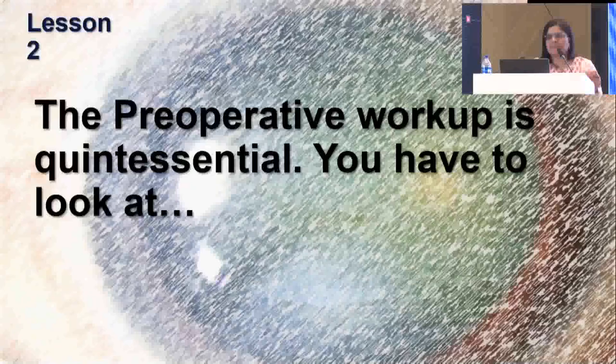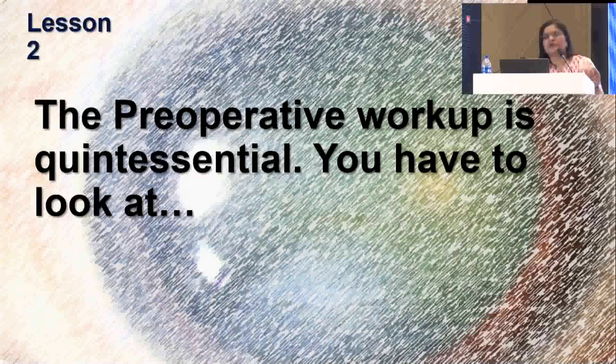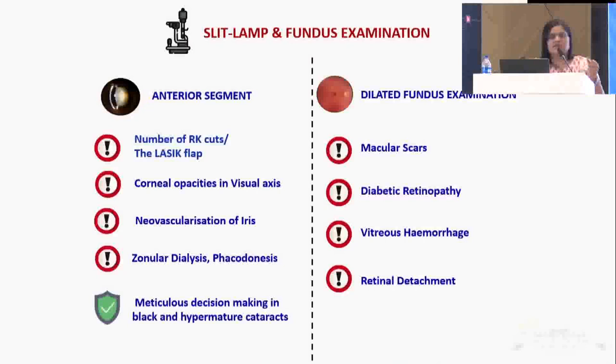With this, lesson number two: the preoperative workup is quintessential. You have to look at the slit lamp and fundus examination, the number of RK cuts, how the LASIK flap is, how many corneal opacities, is there any NVI, is there any ZD, is there any phacodonesis, look for black and hypermature cataracts, look for dilated fundus examination, any diabetic retinopathy, any vitreous hemorrhage, any retinal detachment, all need to be catered to.